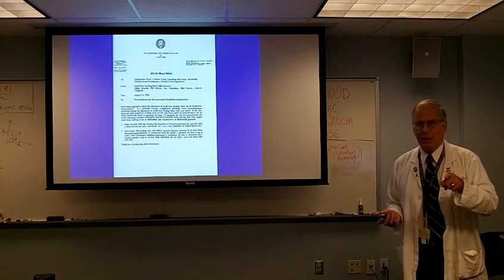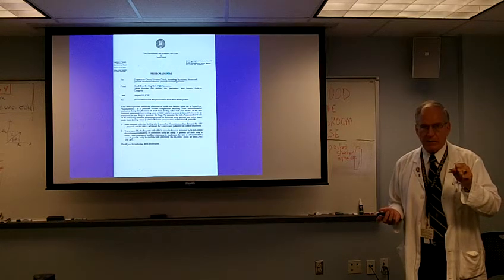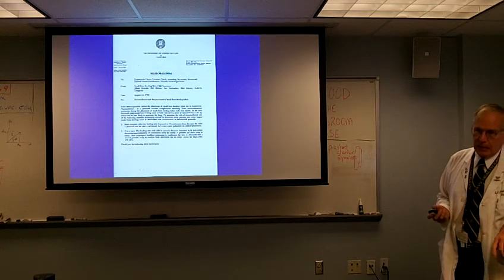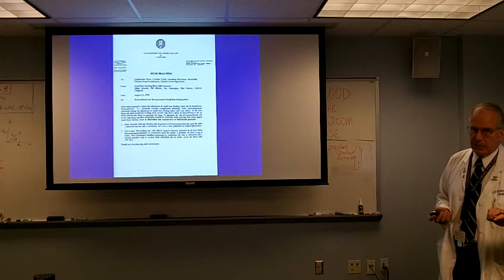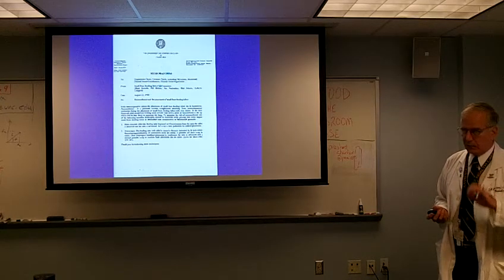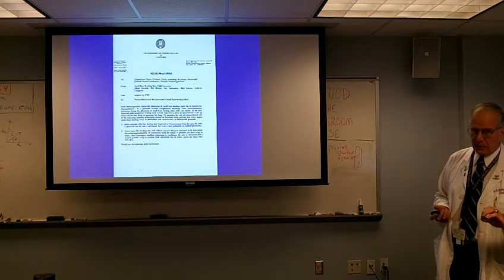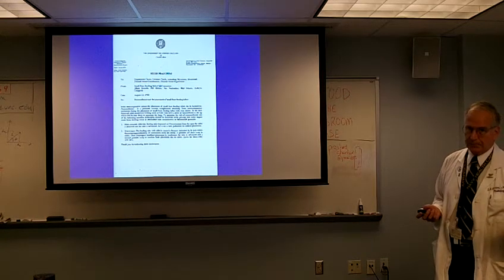Does your hospital have a protocol for feeding tube placement? Okay, it's one of the things you want to be aware of, because it's very easy to pass one of these feeding tubes past that balloon on the endotracheal tube and put it out into the lungs. And so if the tube is just passed willy-nilly without checking the position of the tip, it can go right out into the pleural space, all the way through the lung.